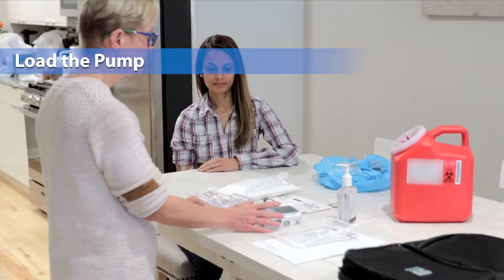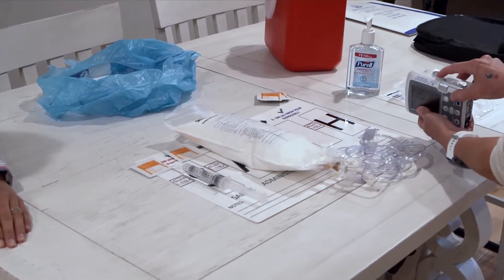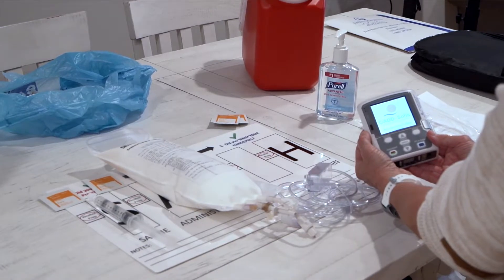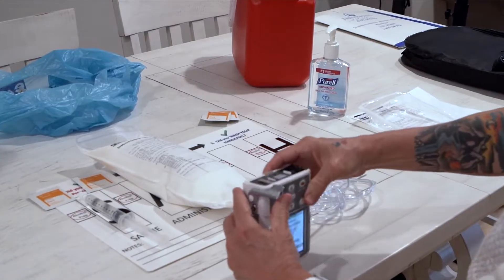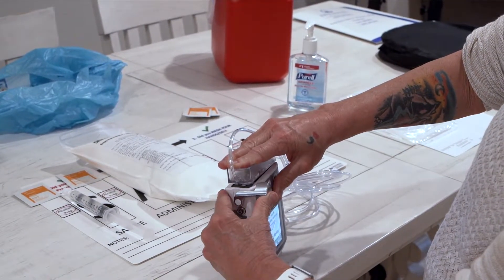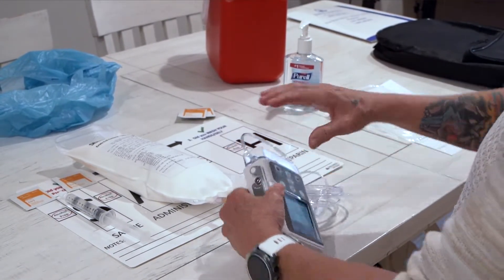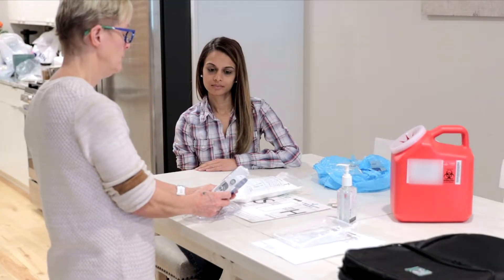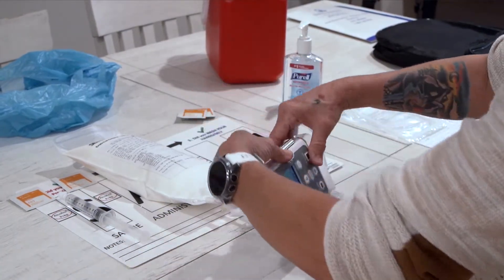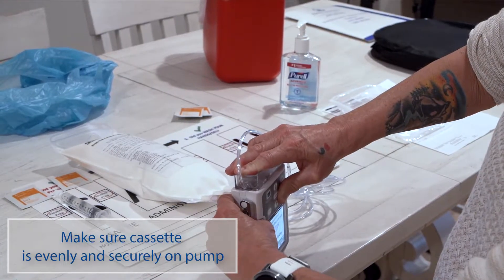Next, load the pump with the TPN bag. Place your new TPN bag with the attached tubing next to the pump. First, turn on the pump by pressing the gray button on the right side of the pump. The pump will light up and go through self-checks — it will beep when it is ready. Then pull the silver latch on the right side of the pump down to unlock the cassette latch. Insert the cassette hooks into the hinge pins on the bottom of the pump — these hinges act like a door hinge. Push up on the cassette until it firmly clicks into place, holding the cassette latch down while pushing up. It may help to place the pump upright on a firm flat surface and press down on the latch from the side until it firmly clicks. If you feel resistance, the cassette is not properly attached — unlatch and try again. Make sure the top of the cassette lines are even with the bottom of the pump with no gaps.